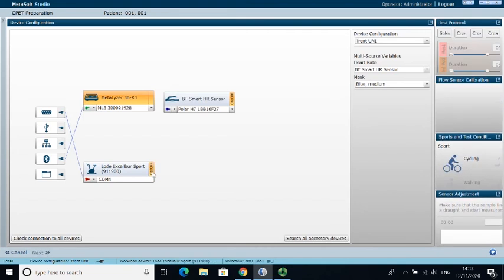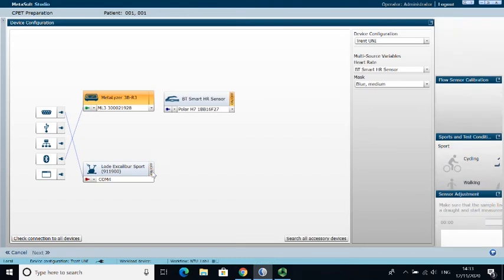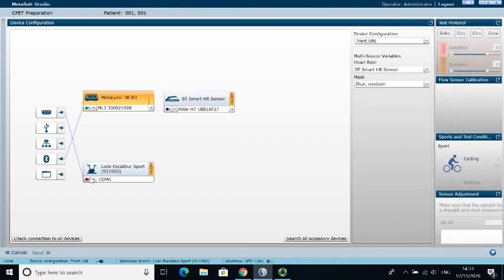And essentially what's happening here is I'm just testing to see whether it's picking up this port or not, and it's saying that it's not, and you can't see this, but in the background I'm changing over leads and things to make sure that it's going to come up green essentially and say that it's going to run the bike for me. And it's done that now. So I'm just waiting for it to confirm that it's picked up the bike, and then I'm going to move on to the next thing.